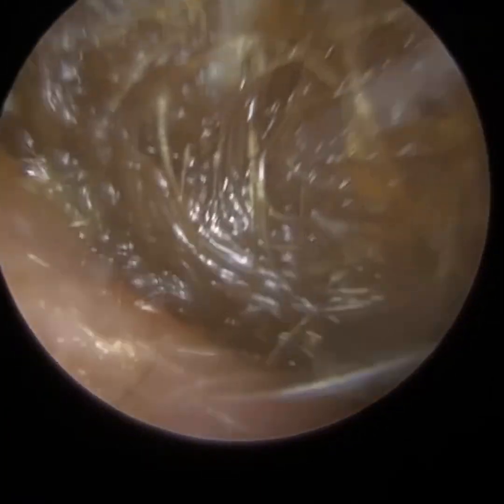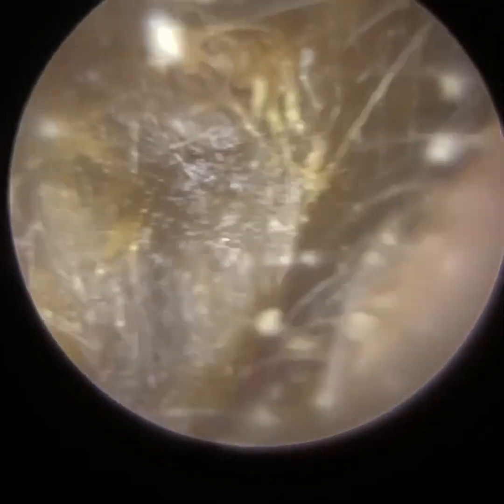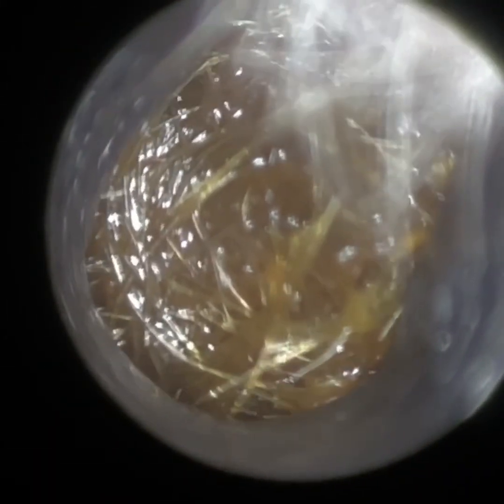Thank you for joining me in another demonstration of the Waxscope. I'm actually using the iClearscope Endoscope to take the pre-procedure video here. You can see they've got bilateral earwax and very hairy ears, so this is a good challenge for the Waxscope.